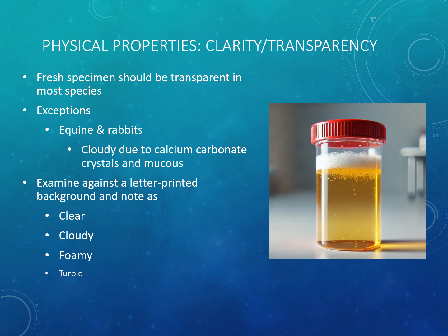So if you're looking through the urine and it seems kind of cloudy, but it's not totally opaque, so we can still kind of see through it. It just looks a little cloudy. Anytime we have any cloudiness to the urine at all, it can be due to different things. It usually means that there's sediment of some kind that's not supposed to be in the urine, whether it be cells or casts or crystals or bacteria floating around. It can be due to mucus or fat.